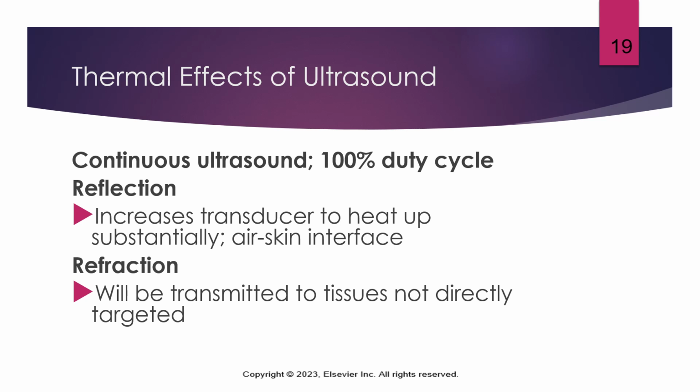Again, we have to think about this refraction. This happens when sound waves bend as they pass through tissues of different densities. We have to be aware of that. This can cause some of that ultrasound energy, again, to travel to tissues not directly targeted. So we have to be really precise with our treatment.